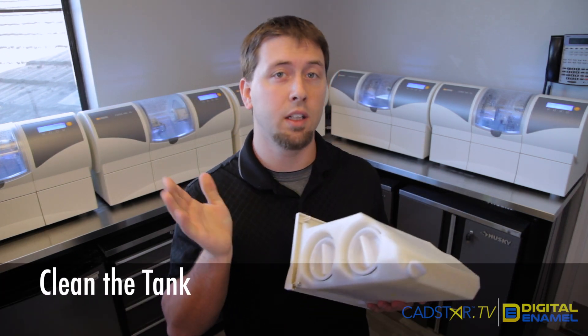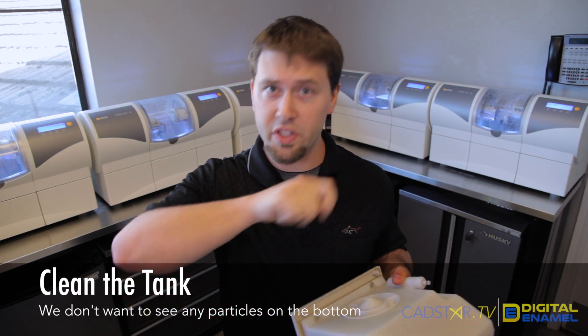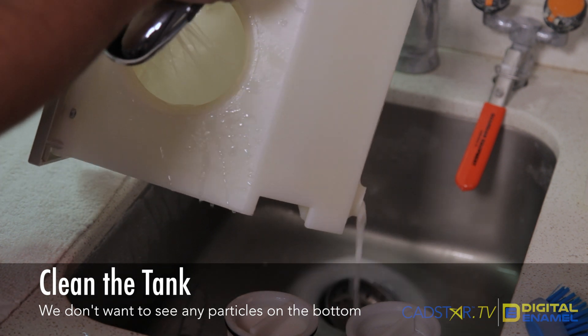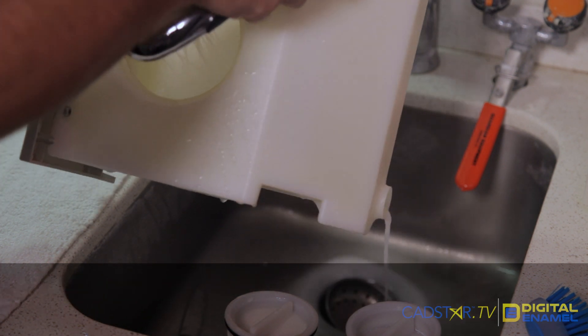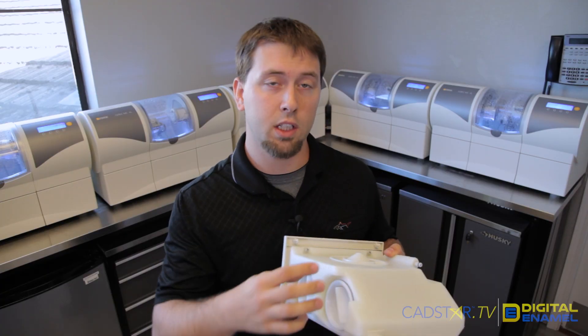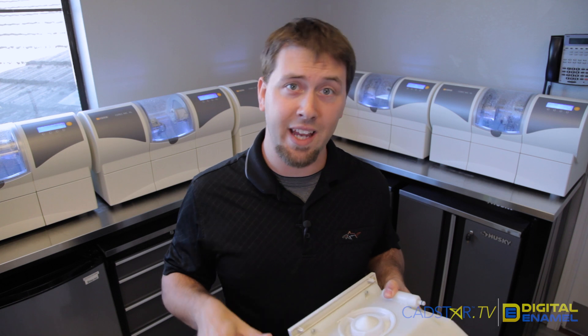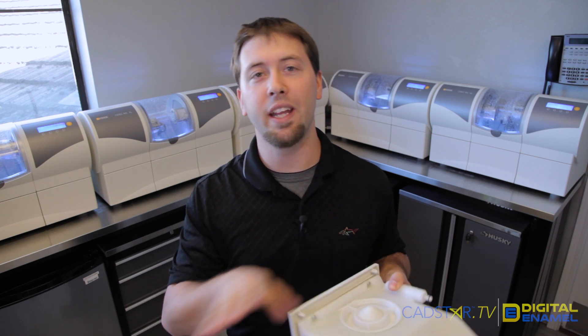Now it's time to clean this out. You want to clean the filters and rinse the tank out really well, ideally with a spray nozzle. If you don't have a spray nozzle at your sink, just fill it with water, close everything off, and shake it well — you don't want to see any sediment at the bottom or any buildup.